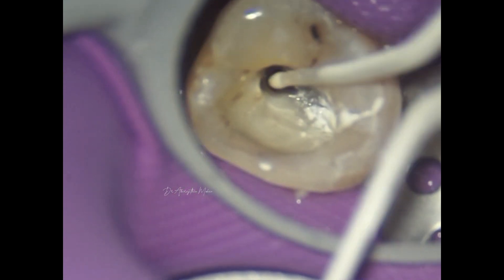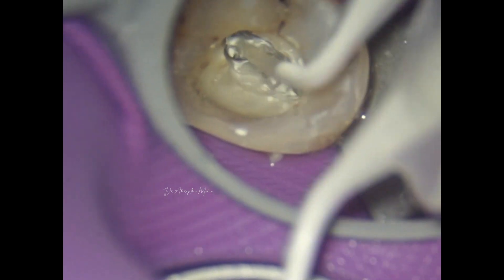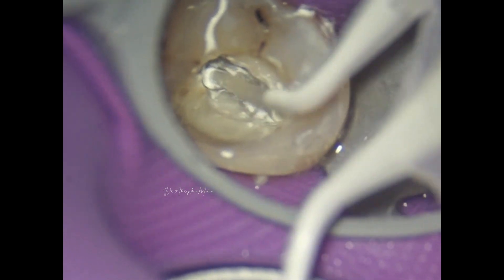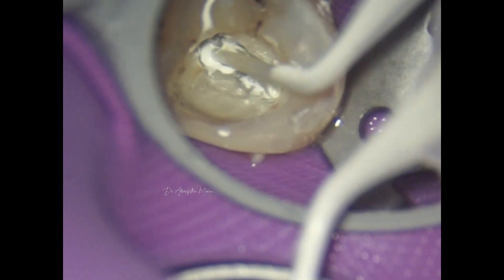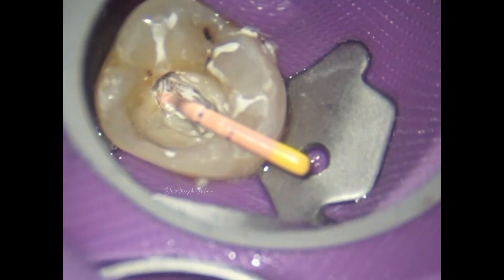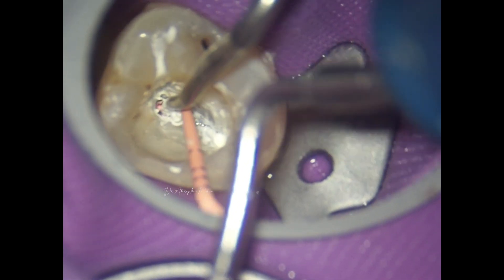I'll share some quick clinical tips for managing such anatomy, especially during instrumentation and obturation. Avoid bigger taper files — these two canals were instrumented with four percent files. And even while obturating, use lesser taper GP compared to your six percent, because the thicker the taper of the GP, when you place it in one orifice, you can easily block the other orifice.